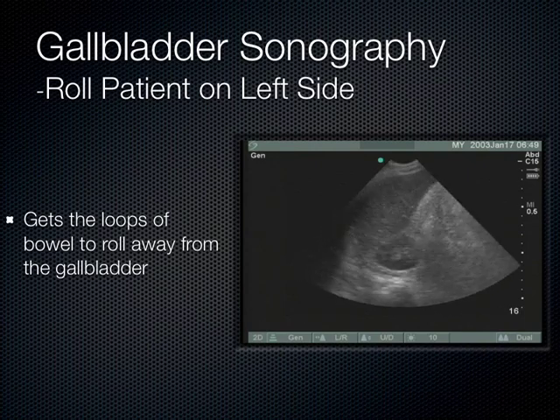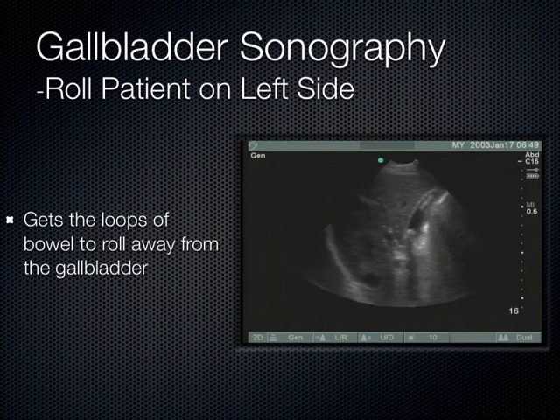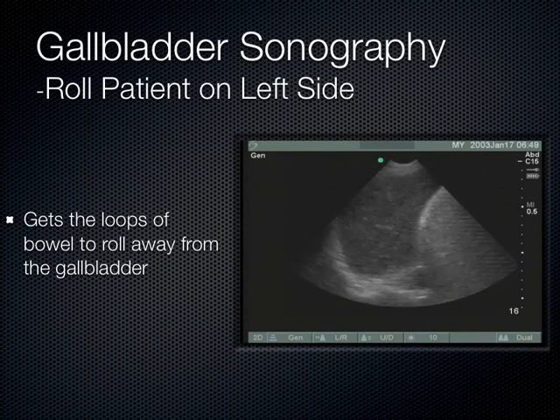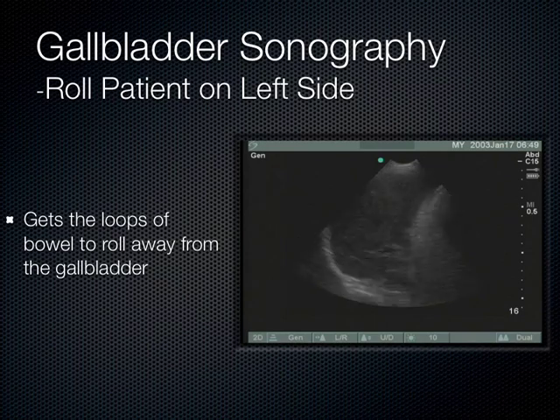There's this one plate on Netter where you take that hook or whatever, and he pulls the liver back, okay, and you can see the gallbladder sitting up here in the fossa, and then you look down, like if you let go of the hook, the whole thing would crash down on what? Good, second portion of the duodenum. So that's where the air is in that duodenum getting in your way. Okay, and that's always going to be the problem with the gallbladder. The air in the duodenum fouls up your gallbladder image.